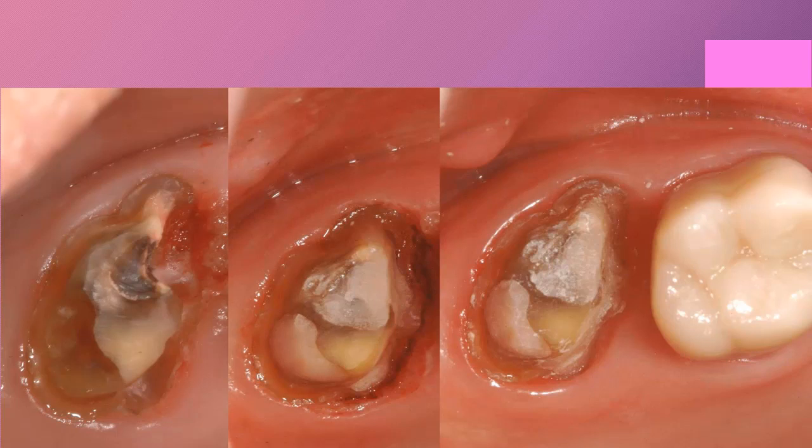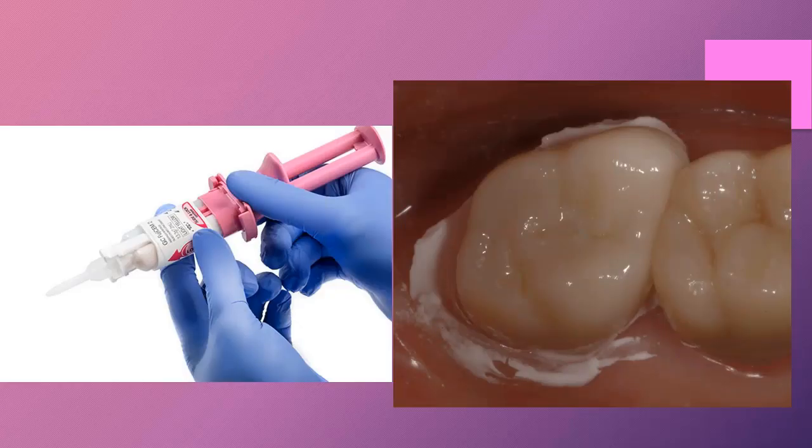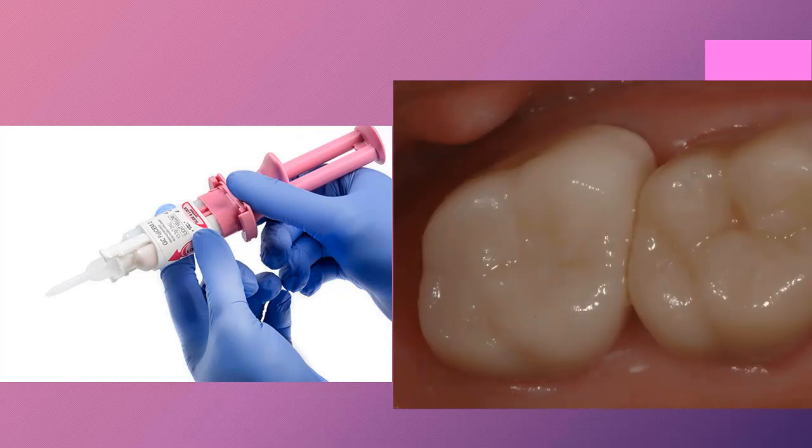If you're going to try and do this with resin, you know the failure is going to happen because of the resin. There's no way to isolate this properly. So you can see this restoration going in using a glass ionomer cement. Very easy to clean up, as we all know, which makes it nice. We've all used these. So we know the fundamentals of using a simple product like this, and we know it can work very well. All right, easy cleanup, quick and simple to put into place.